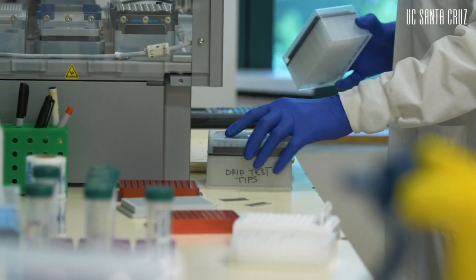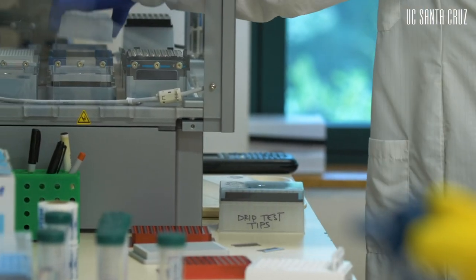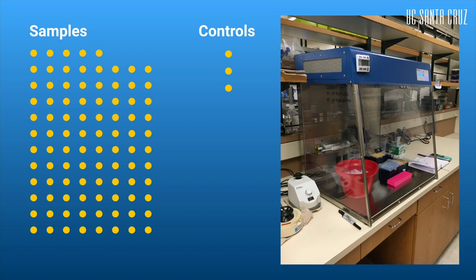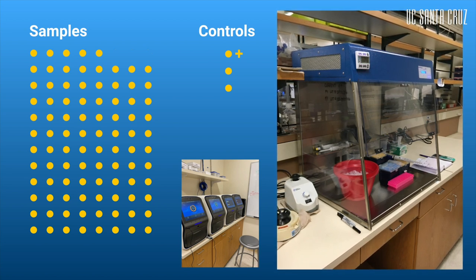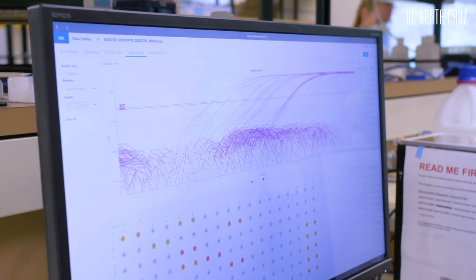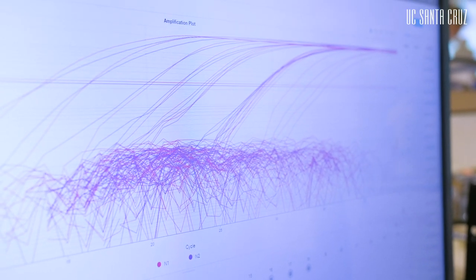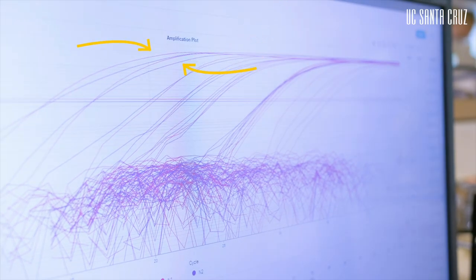To build this assay, we took primer and probe sequences that recognized SARS-CoV-2 developed by Columbia University. We then modified the RNA extraction method and reagents to avoid reagents that are in limited supply. Finally, we implemented the assay in a 96-well plate format so that 93 samples and 3 controls can be processed simultaneously using our robots. Once those samples are run on a thermocycler, the data is outputted. We load a positive control to ensure that the reagents are working as planned and we can detect the virus. Whether a sample reaches that threshold or is below that threshold determines whether the patient is positive. RP is the internal control that tells us that we've collected enough material. N1 and N2, depicted in purple and fuchsia, measure the presence of the virus. N1 and N2 are amplified in the sample, indicating that the patient has COVID.